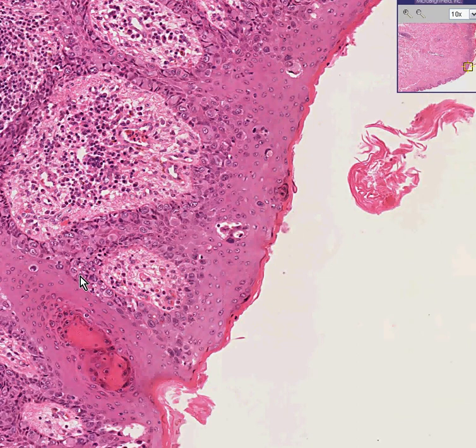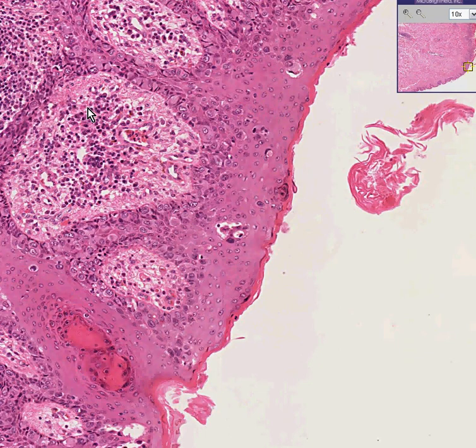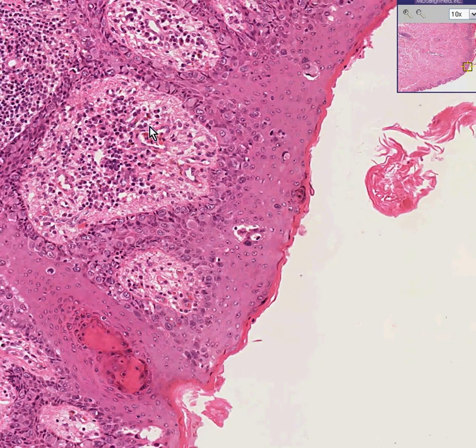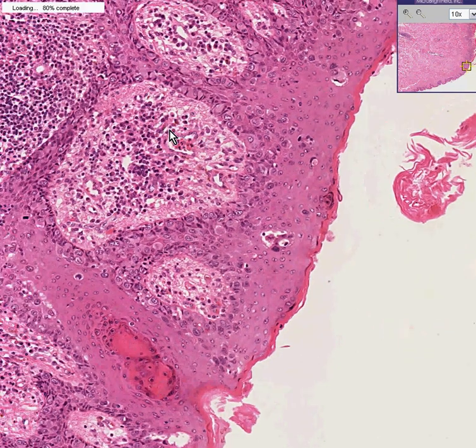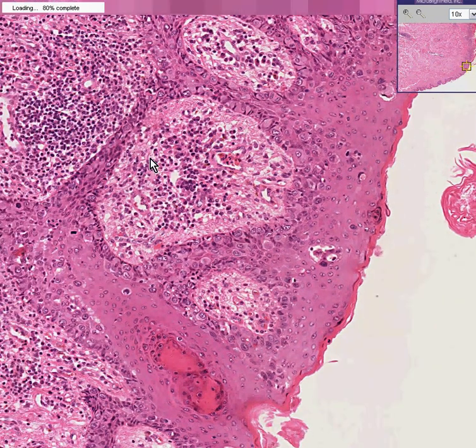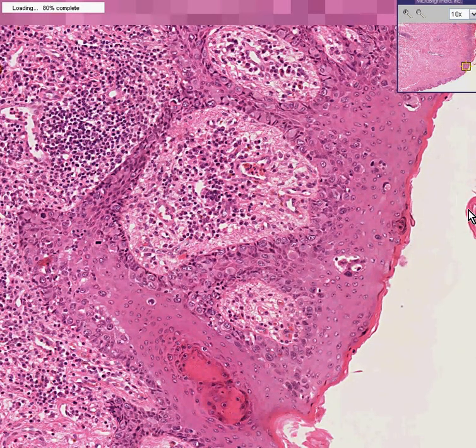These are Paget cells — here's one, here's one, here's one. They are the cause for the amount of inflammation you see here and perhaps some secondary reactive hyperkeratosis as well.